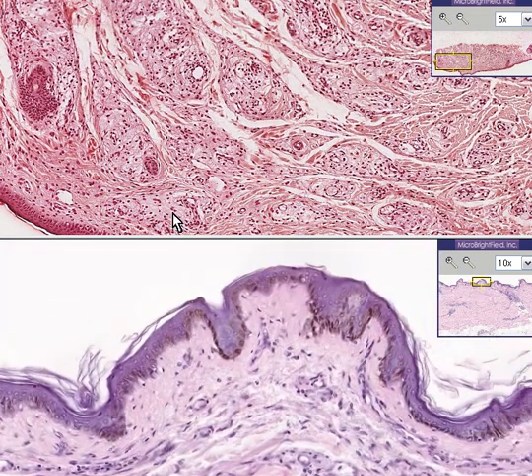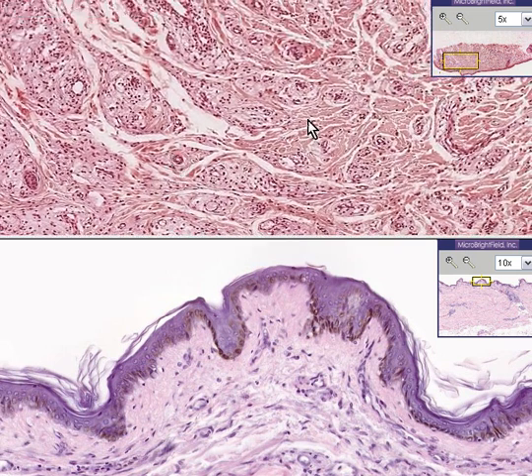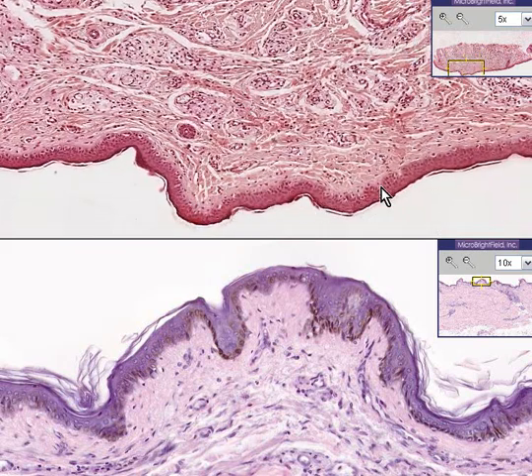Well, let's look at the top. I think you can recognize that skin. I think you could see a stratum corneum here. I think you could see a papillary dermis. I think you could see some remnants of skin appendages. There's a hair follicle. But take a look at the dermis. It's not the epidermis which has the changes of note. The epidermis here is pretty normal.